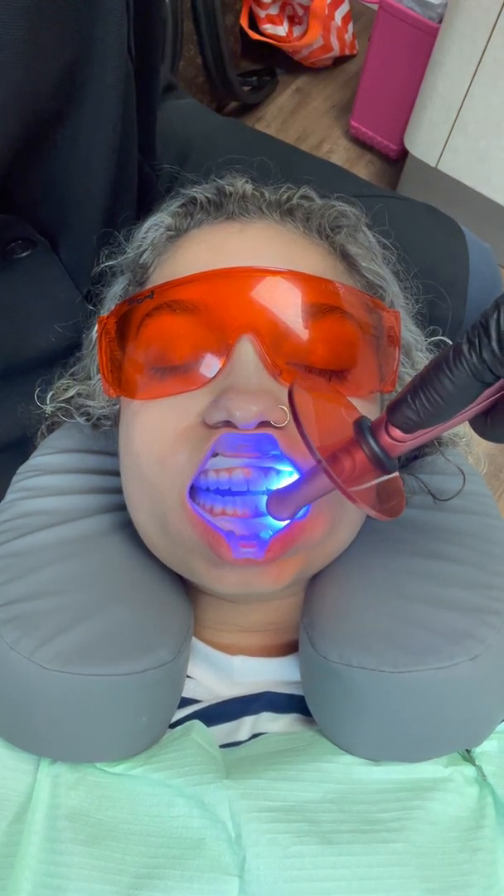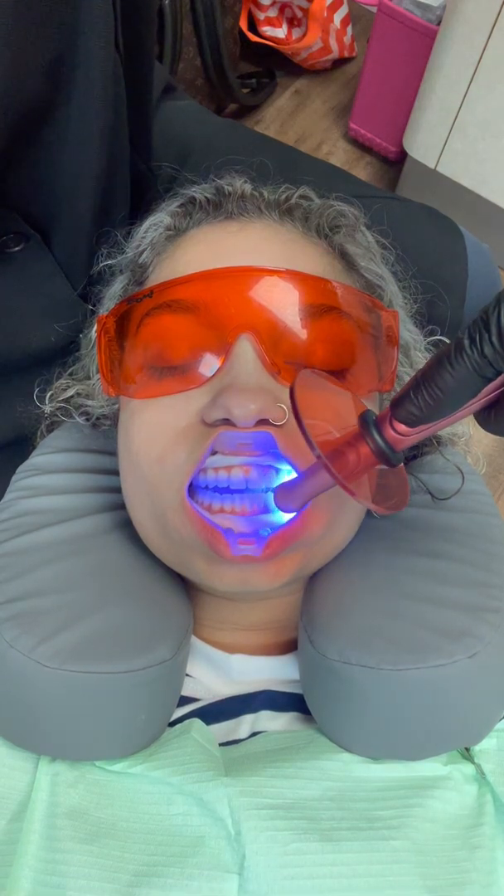I'm going to go three teeth at a time — Haley, open for me just a little bit — and I usually try to start back here at the second premolar. Notice what I'm going to be doing here is attaching it to the two-by-two, and I'm only going to do just a little bit at a time because I like to do about three teeth at a time, then cure it, and keep going.